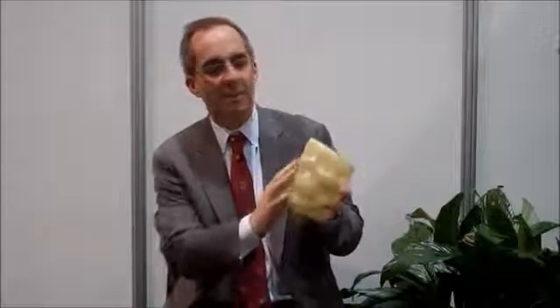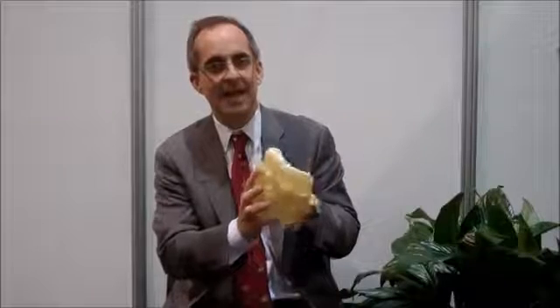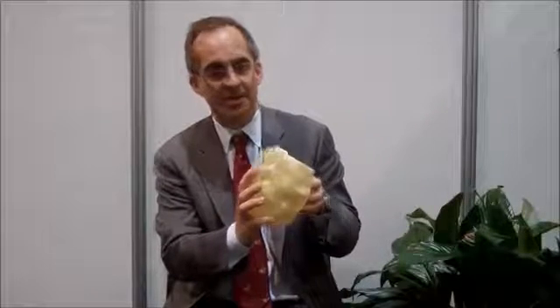And there's no other way to represent these soft tissues, and so the real usefulness in the soft tissue models, which we're really appreciating currently, is that we can actually investigate this and we can document, not just by photographs, but by a handheld model, what types of soft tissue that she had at the time of the surgery.